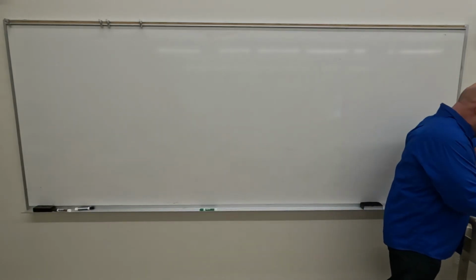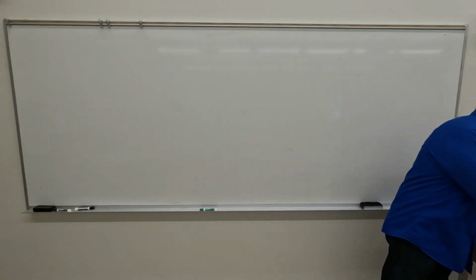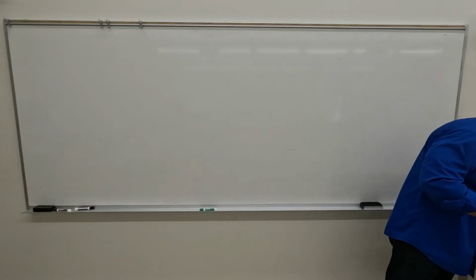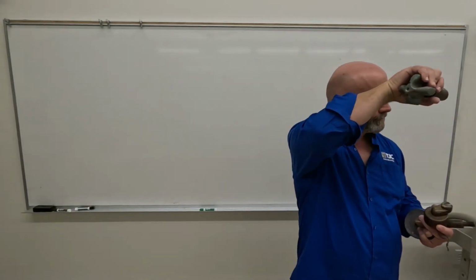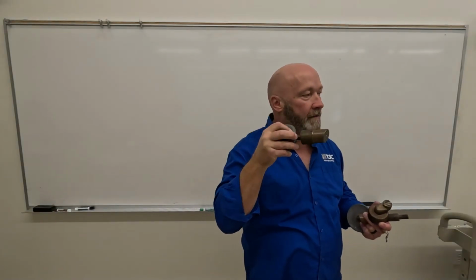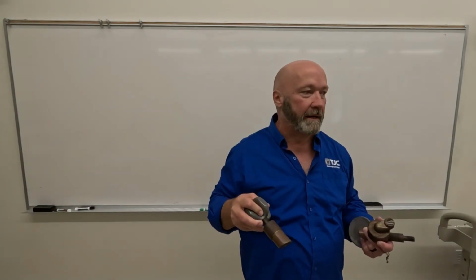I'm going to pass it around last, because that's not really what we're talking about today. So let's go like this. What I want you to notice on the anodes is what the anodes look like. So, stationary anode. The problem with a stationary anode is that all electrons you send from cathode to anode bombard in exactly the same spot.